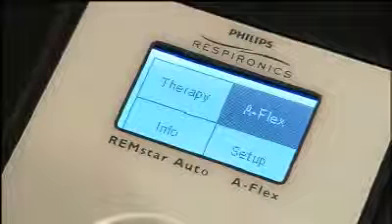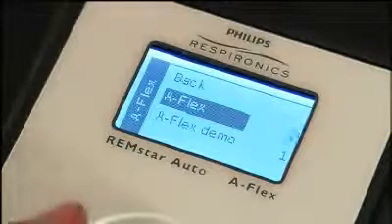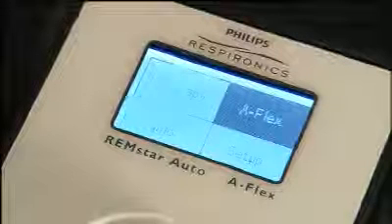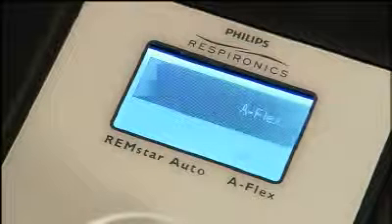There are a few other features on your device that you may want to explore. With the device on and the home screen displayed, turn the control wheel to highlight flex and press the wheel down to select. Your screen will display A-Flex, C-Flex, C-Flex Plus, or Biflex, depending on which System 1 device you're using. The Flex Comfort feature lets you adjust the level of air pressure relief you feel when you exhale during therapy. You have three levels of relief to choose from. Your home care provider may enable, lock, or disable this feature. If it's enabled, turn the wheel to highlight the Flex level and press the wheel to select it. The Flex demo gives you a chance to try out the three different levels. When you're done, turn the wheel to select back and press to return to the home screen.